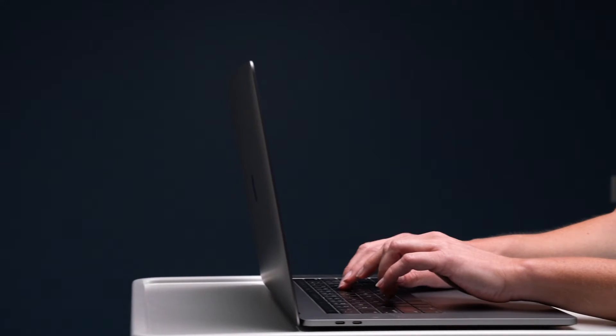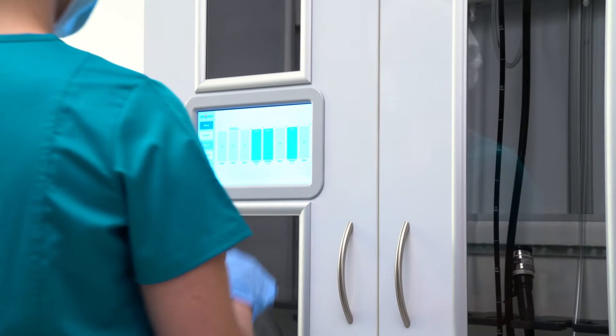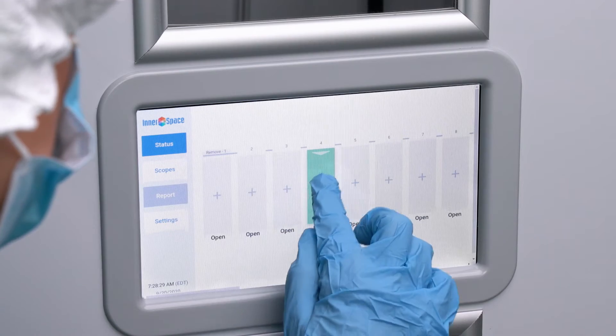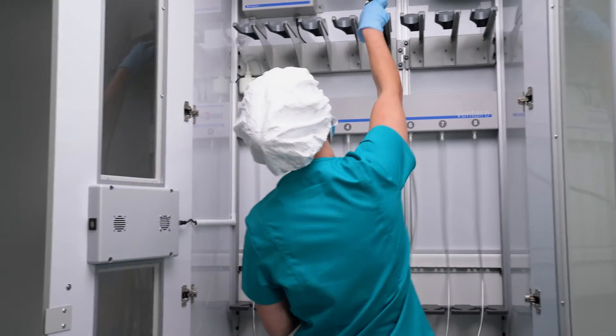You can also monitor the system remotely via the Innerspace Smart Solutions website. Either interface displays real-time information, including scope locations, drying, venting, and storage times, and channel availability.